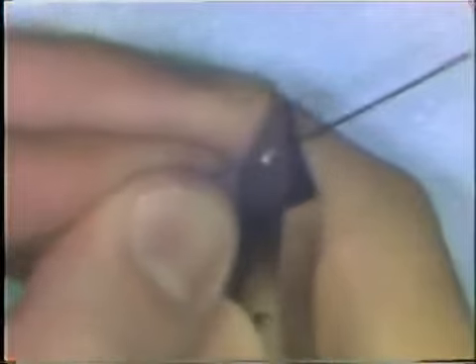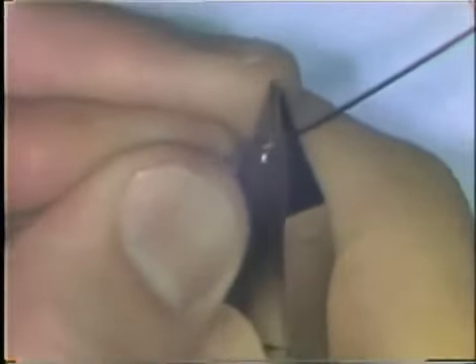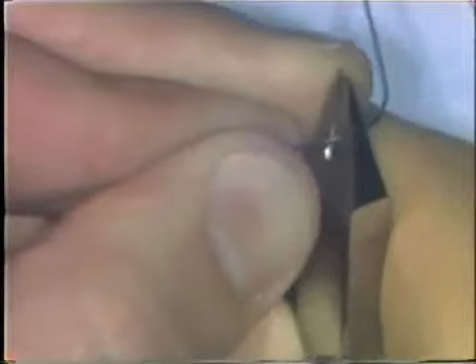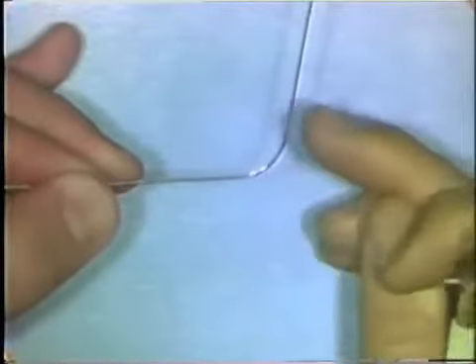Using your thumb, make a series of very tiny bends very close together in the wire, and this forms a curve. You slide the wire along through the beaks and apply pressure. Your fingers can be a little bit away from the plier beaks for formation of a curve. You'd like the curve to be smooth and continuous.